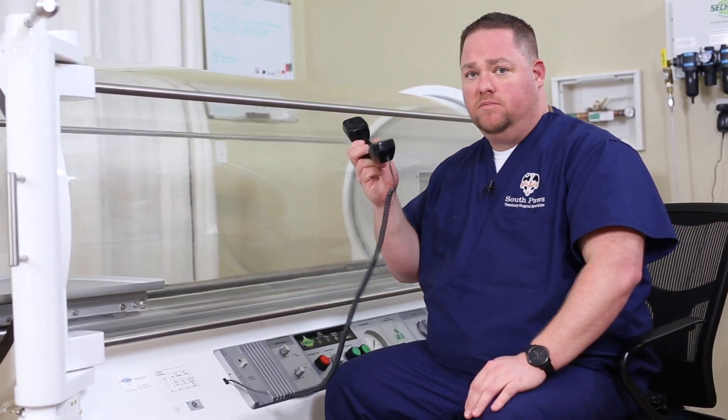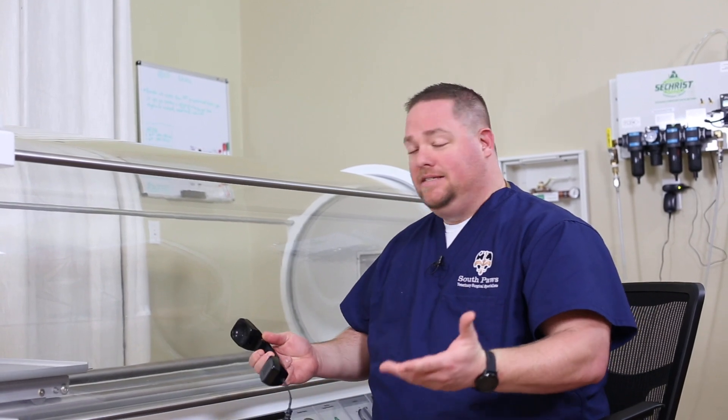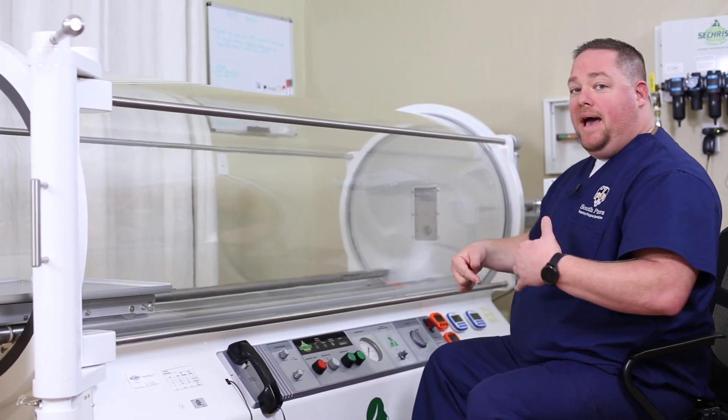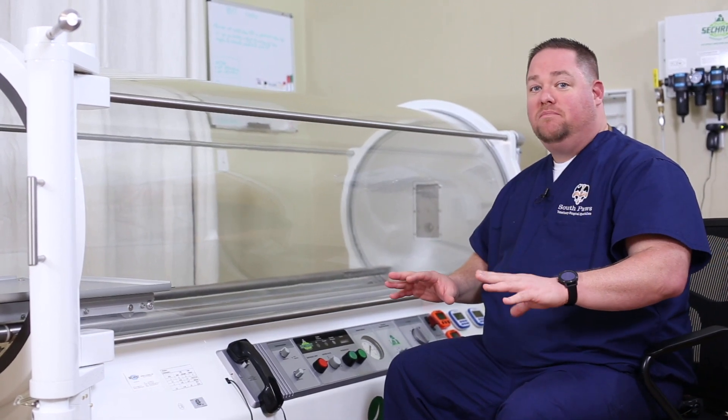I know this sounds funny, but in all the human chambers comes a telephone so that you can talk to your patient. I actually really love this feature because sometimes if there's a lot of anxiety in the patient, we can talk to them and get them calmed down, get them to lay down. It's actually been a lot more useful than I thought it would be. It also has a plug-in in the back so that if you did want to stream some music to calm the patients, you can.